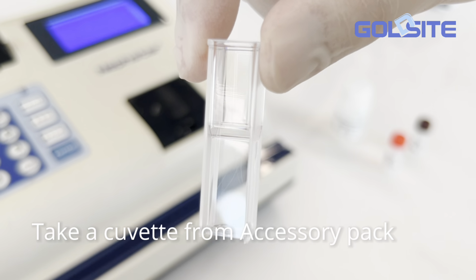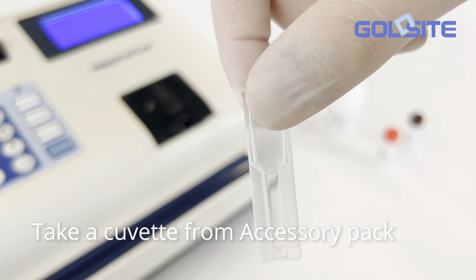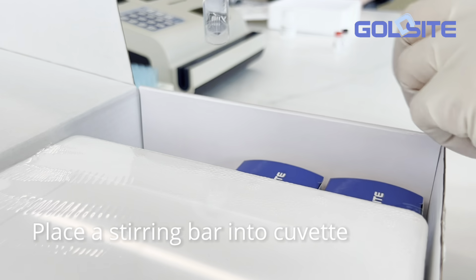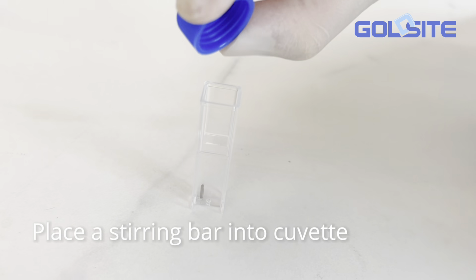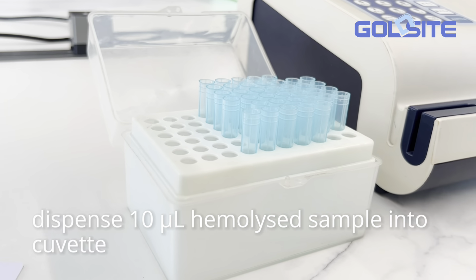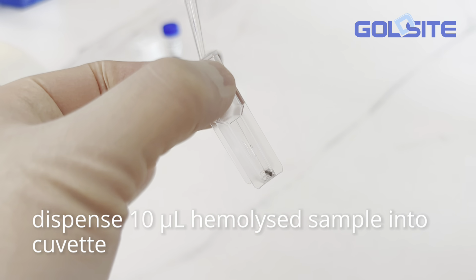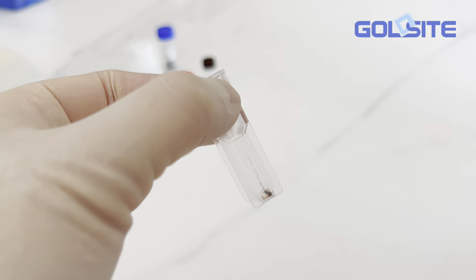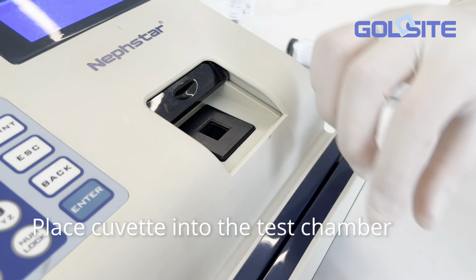Take a cuvette from the accessory pack. Place the stirring bar into the cuvette. Dispense 10 microliter hemolyzed sample into the cuvette. Place the cuvette into the test chamber.